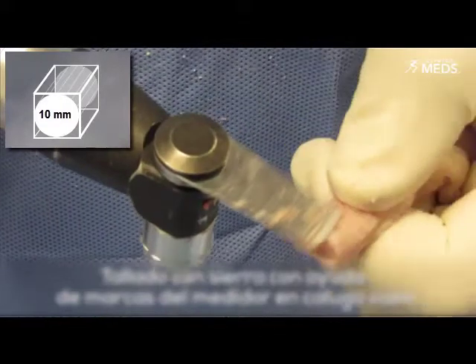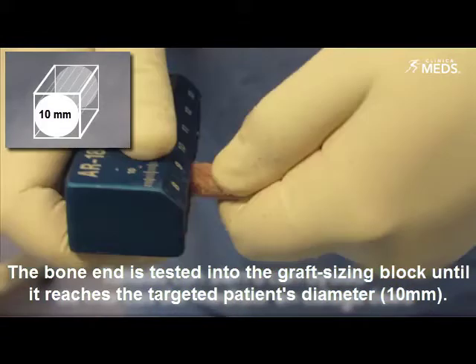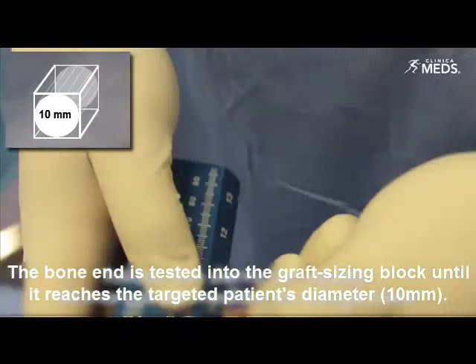The surgeon should remove the excessive surrounding bone tissue until obtaining a cylindrical shape. The bone end is tested into the graft sizing block until it reaches the target patient's diameter.